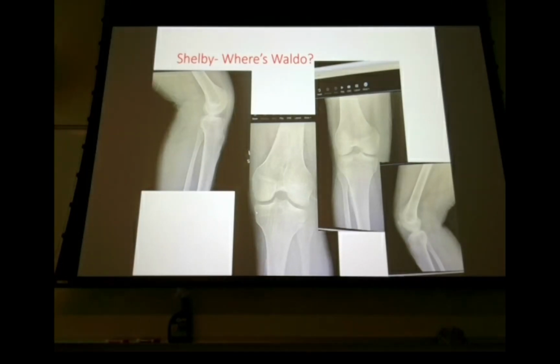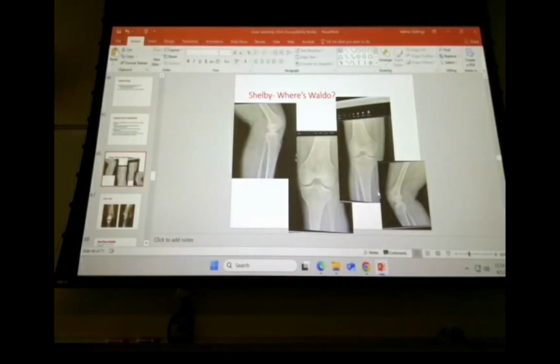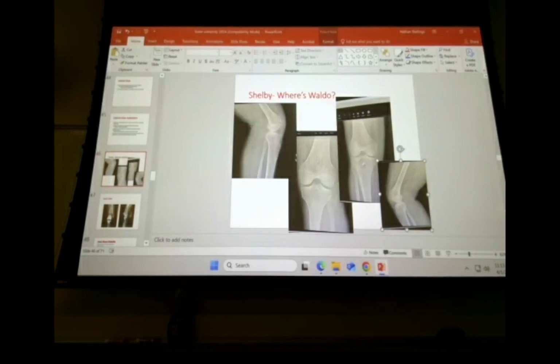Patella. The patella is gone. And I wish I'd have put the report on this. Did this patient walk? Yeah, so he walked. He is fine, physically he's fine. I just have so many questions. You can see a tiny little patella over here. I don't see one there.